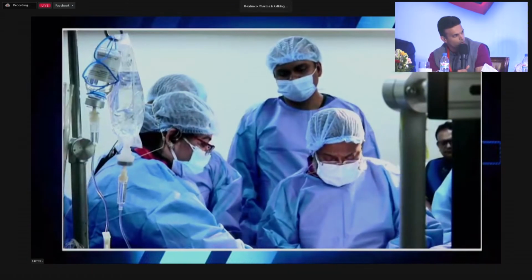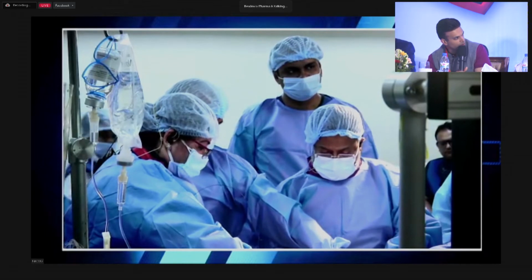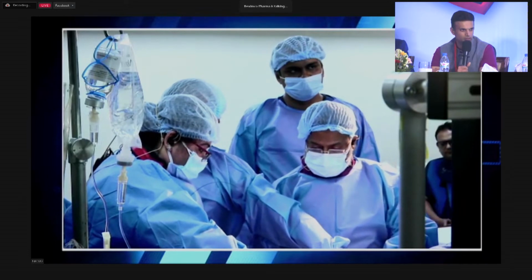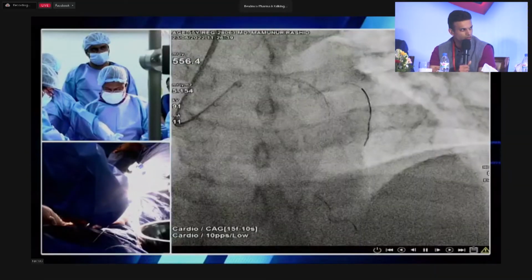Totally in agreement. Just to the panel, what are your thoughts on inflation times? How long do we need to keep a balloon up to make sure that a stent is fully expanded? And this is sort of historic because we post-dilate most things now, but let's say you're doing a left main and you're doing the typical get in, get out. How long do you really need to put the balloon up in order to get appropriate stent expansion?